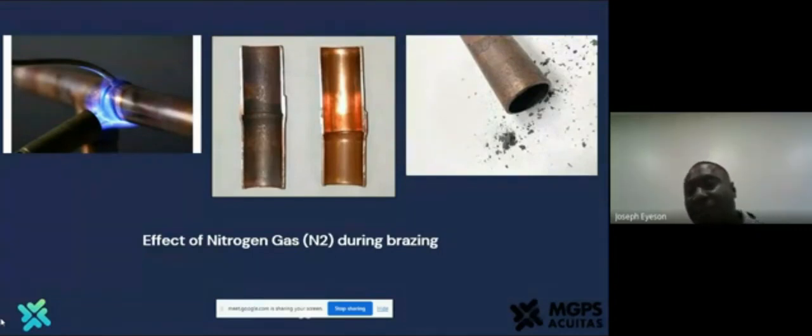But for the cleaning, you have to use a fine material. There is a fine material used in cleaning copper pipe that you can use to clean the entire pipelines once again. Other than that, you don't need to clean the pipe during maintenance unless you see some deposit or the pipe comes in contact with things that are not supposed to be there. That is where you have to do the cleaning on the pipe and then rectify the problem of whatever is coming in contact with the copper pipe. Yeah. Thank you, Jim.